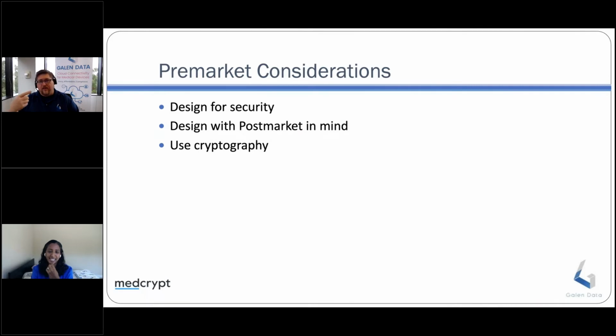And now you're stuck in that every 90-day review cycle because they noticed something else that you didn't do. This goes hand in hand with implementing design controls. Design controls and security should be like this. If you're doing one, you should absolutely be doing the other, and make sure that you're moving forward with those as the top line considerations.